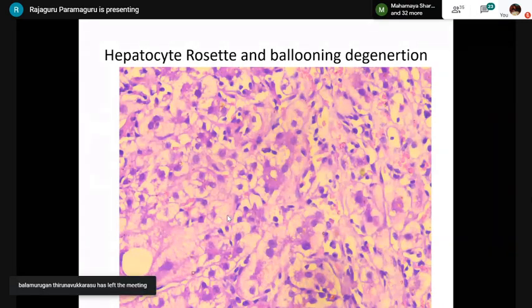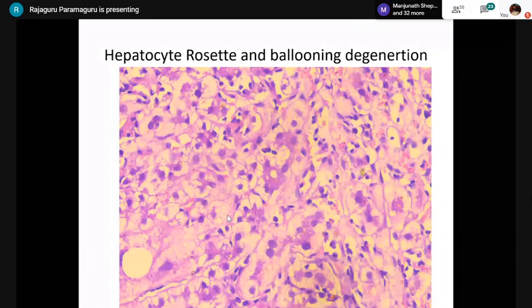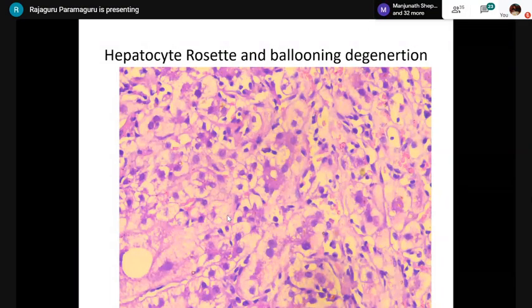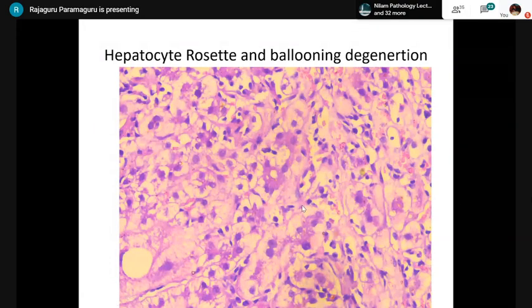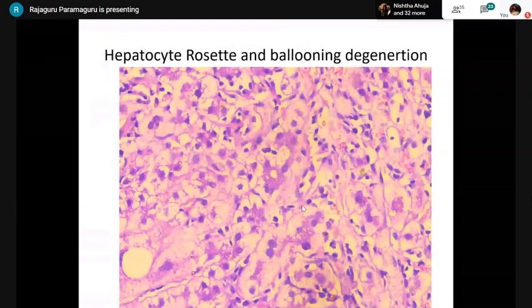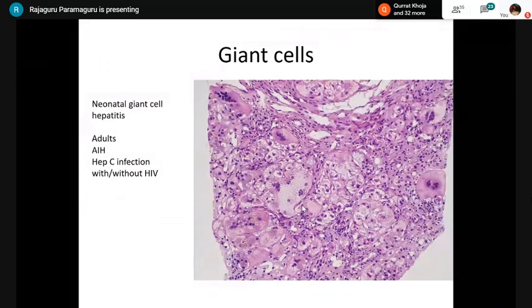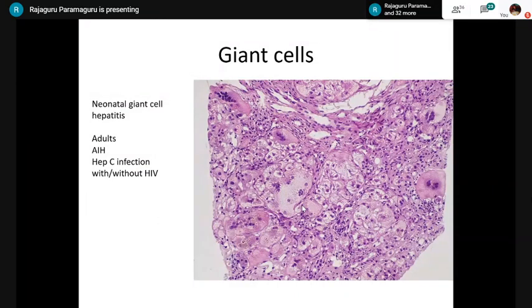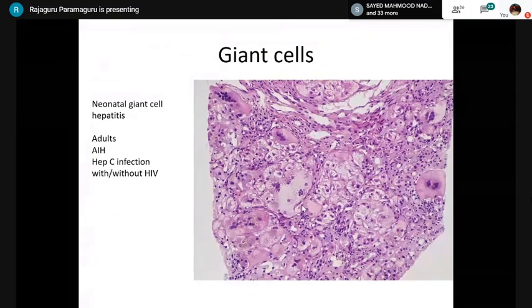In acute hepatitis, the change is called 'ballooning degeneration.' In steatohepatitis, it is called 'hepatocellular ballooning' or 'ballooning change' — not ballooning degeneration. In ballooning degeneration (acute hepatitis), CK8/18 staining will be objectively normal with no loss or absence of staining. Giant cell transformation can be seen in neonatal giant cell hepatitis; in adults (post-infantile giant cell transformation), it can be seen in autoimmune hepatitis or hepatitis C infection.